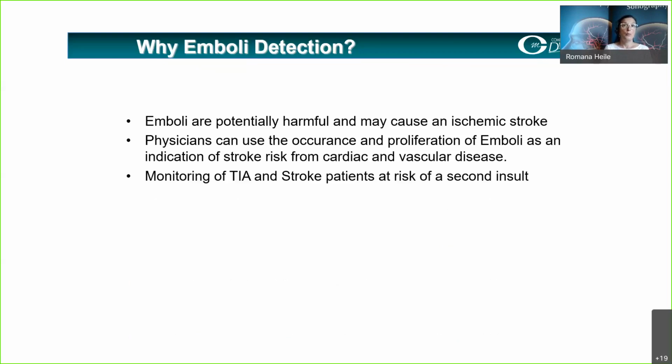If doctors do emboli detection and still see emboli in patients who have already suffered a stroke, that means they probably have a higher risk of a second insult.